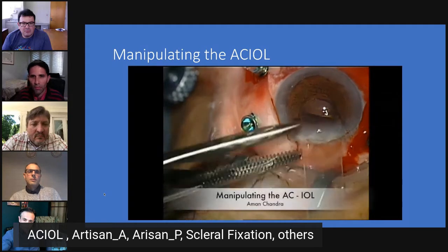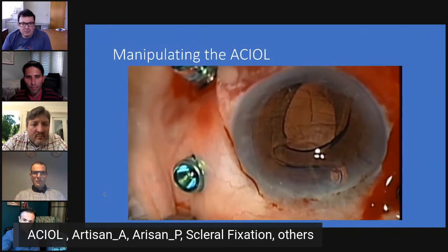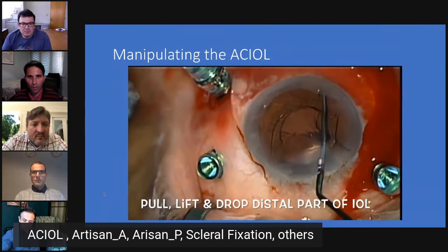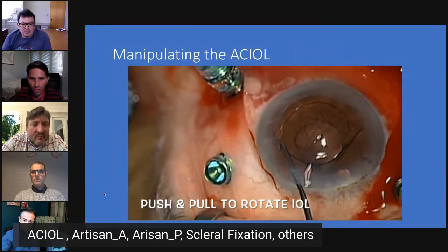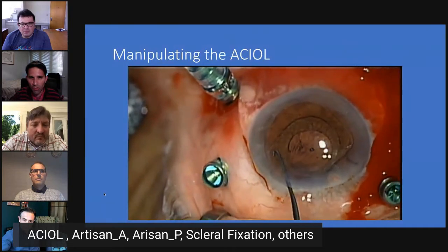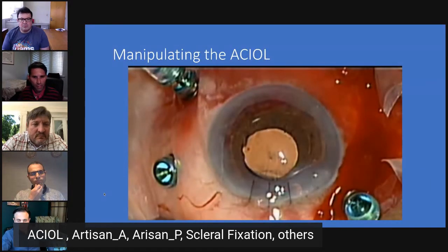So if you're going from the top, such as in a vitrectomy like here, we put the IOL in with a Sheets glide similar to before. Now, as Ahmed described, I like to go up to the optic, lift and drop. Pull, lift and drop. And then you're more likely to get it into the right part of the angle. And then a push and pull to rotate the IOL so that it's horizontal, and then you have it in a horizontal plane in the anterior chamber. Oh, there we are. That's my videos.